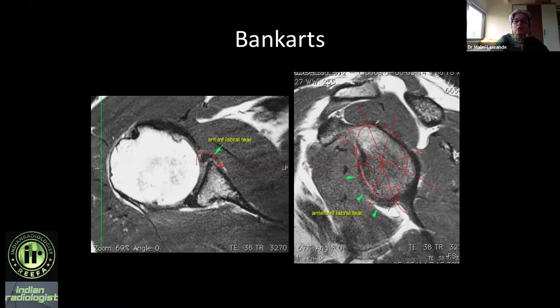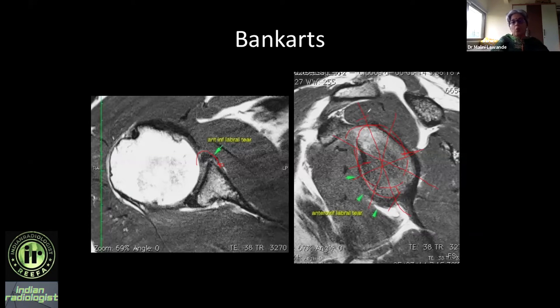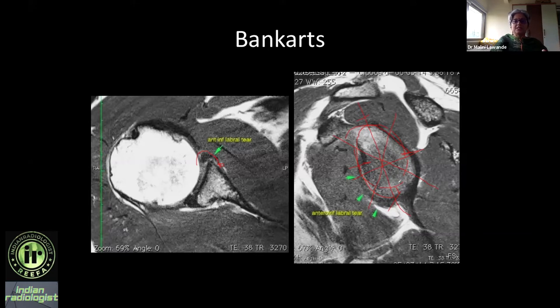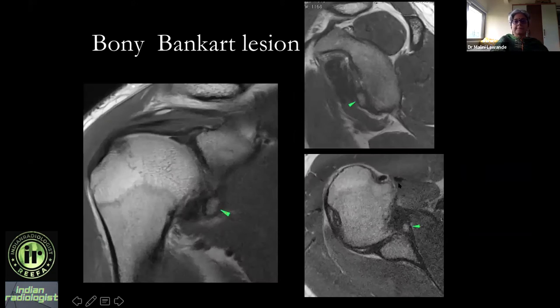You may see a tear involving the entire anterior labrum extending across twelve o'clock up to the posterior equator — for example, superior labral tears. There are classifications with ten or twelve types, but if you describe the full extent — involving entire anterior labrum going across twelve o'clock up to the posterior equator — that is good enough.